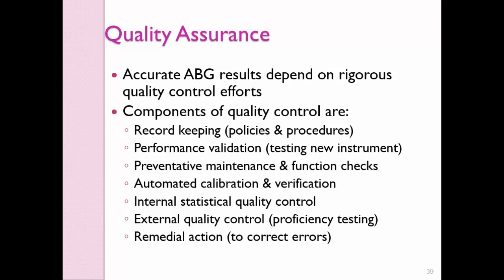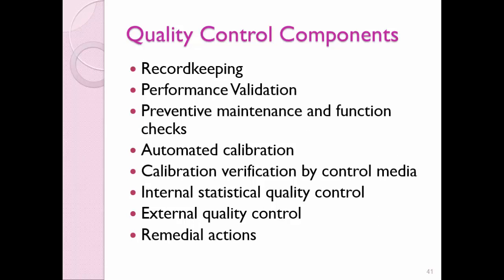And then remedial actions, anything you would do to correct errors, whether you're changing the electrodes, you're replacing the electrolyte solution, or you're running a 2-point cal, whatever you're doing, you have to document that. So QC components, the record keeping is obviously of vital importance, simply because it can be a legal document also.